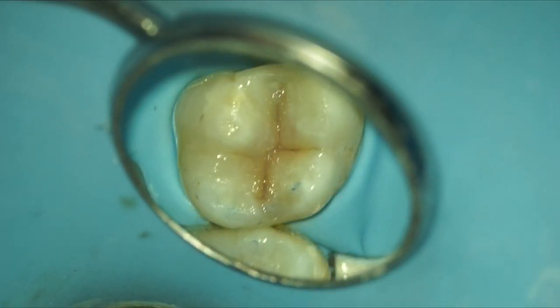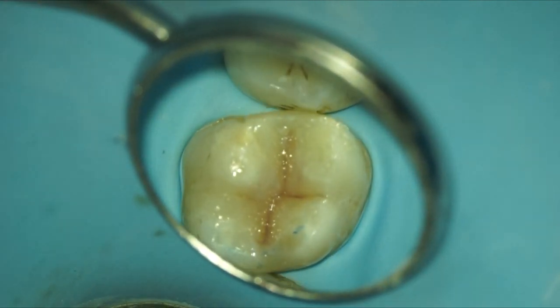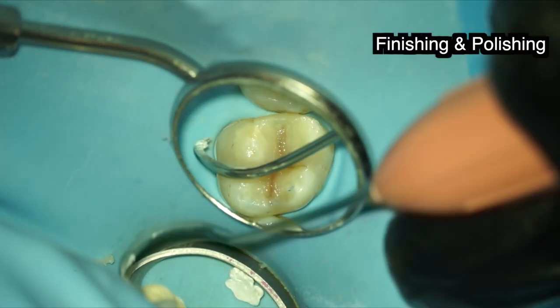The filling is now in place, time for finishing and polishing. I use quite a lot of instruments for this, but the idea is to create smooth edges so you can floss without tearing the floss itself.